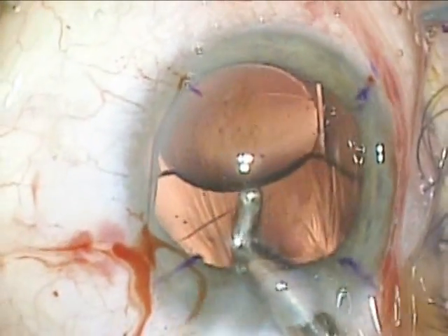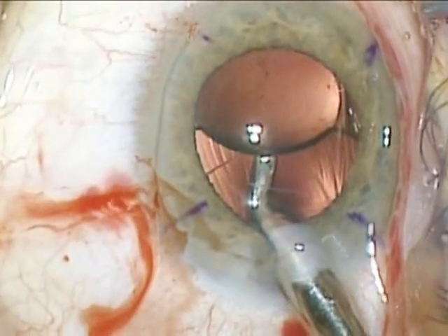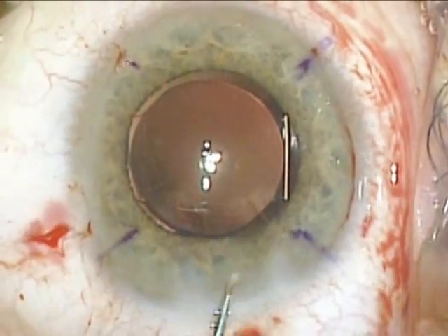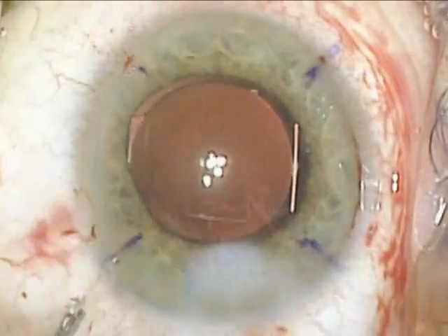I'll remove viscoelastic from underneath the lens and over the lens. Then I seal the paracentesis and main corneal wound and make sure that the lens is in its posterior position.